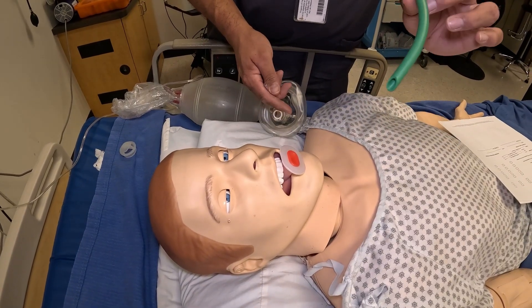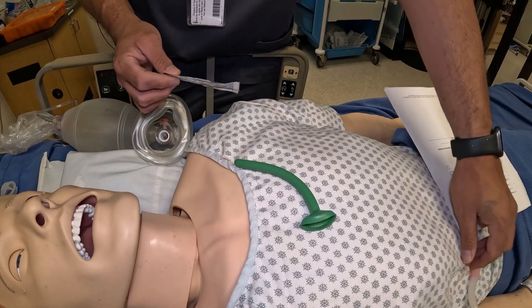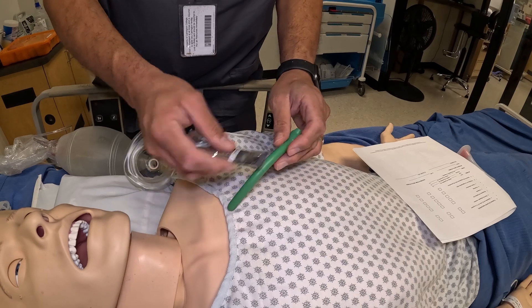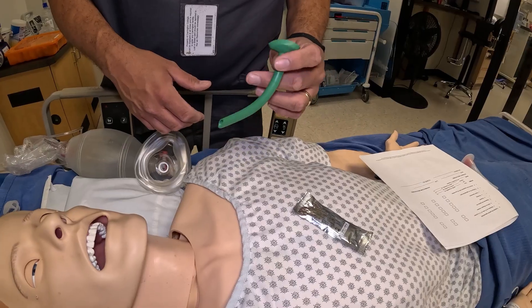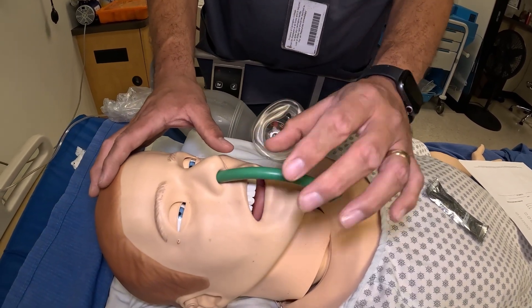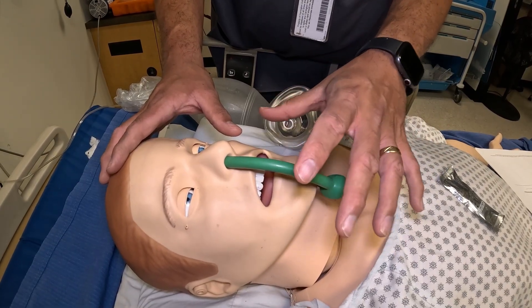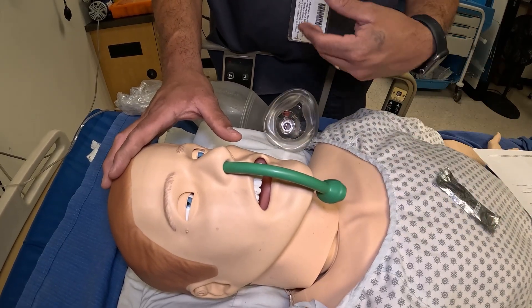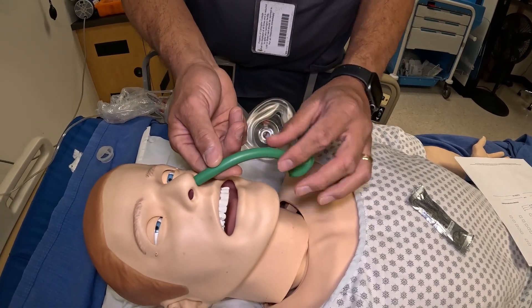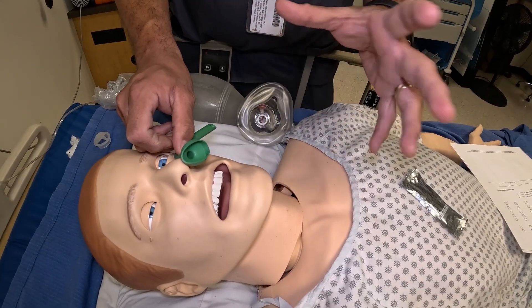For the NPA: always have water-based lubricant — do not use petroleum-based lubrication. Apply a generous amount of lubrication. Follow the anatomy of the nasal passages when inserting. If you meet any resistance, do not force it — there could be a deviated septum or blockage, and forcing it could cause bleeding. Try the other nasal passage instead. Insert it all the way until the flange rests at the nostril, then leave it in to keep the airway open.